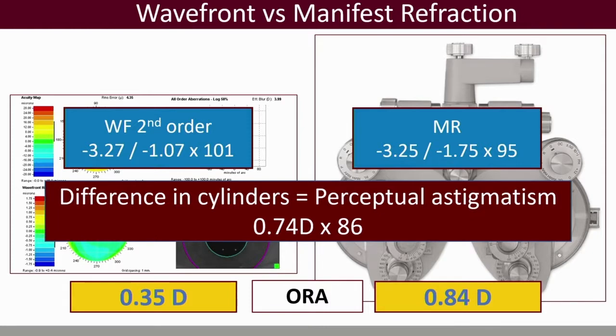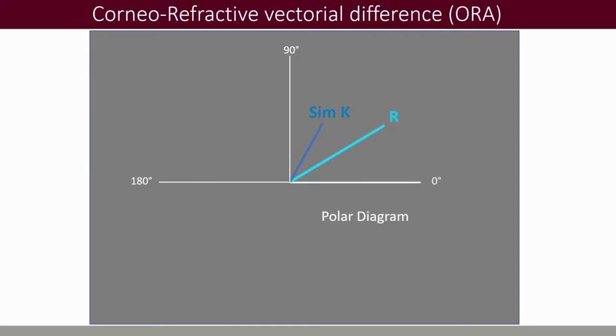But it can go either way, so I don't think this is a trend that you'd want to depend particularly on wavefront aberrometry. So in other words, the point I want to make here, just to start off, even on a cataract type thing, is that if you're going to treat this eye by manifest refraction, and you're going to sculpt that using 100% refractive parameters for a laser surgery, for example, you're going to leave somewhere between 1/2 to 3/4 of a diopter of astigmatism extra on the cornea that isn't even correcting optical astigmatism. It's actually correcting something that's non-optical, the way the patient sees it, even though it's not an optical component. So you're going to leave a whole lot more astigmatism on the cornea for what is a non-optical component, which is important, even for also implant surgery, as I mentioned.